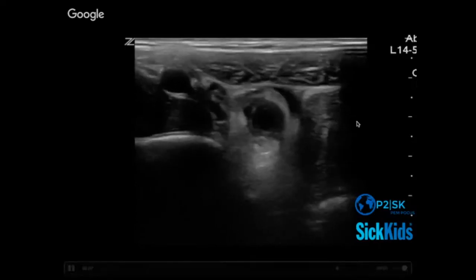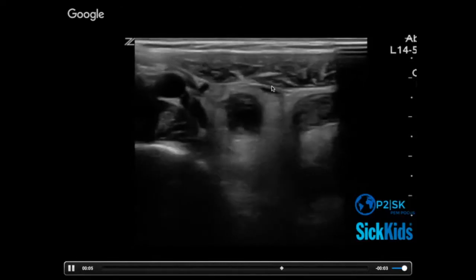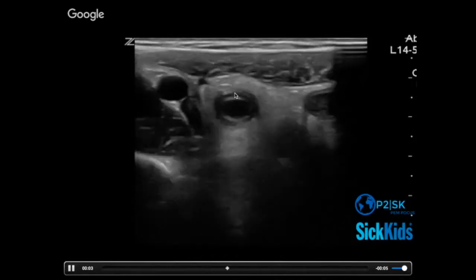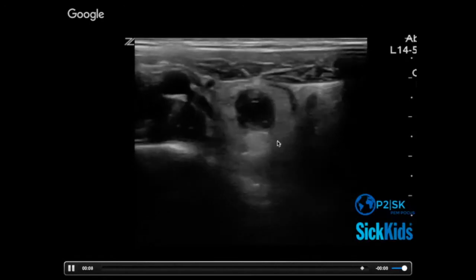Free fluid. Yeah, you see that little halo of free fluid that comes up at the end. Hot fat, no. Hot fat. Yeah, I think you can argue. Now, at the beginning, you see it's a little bit smaller. As the clip plays out, it gets a little bit bigger as it dives deep.